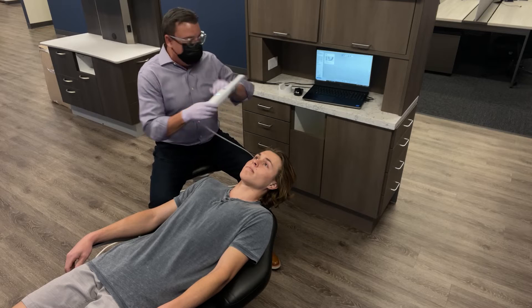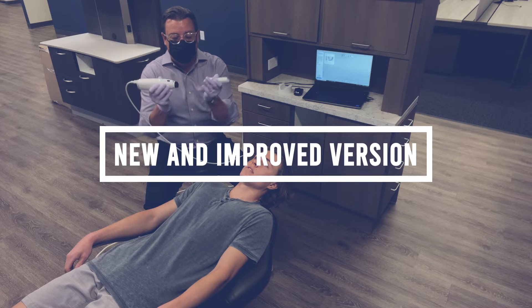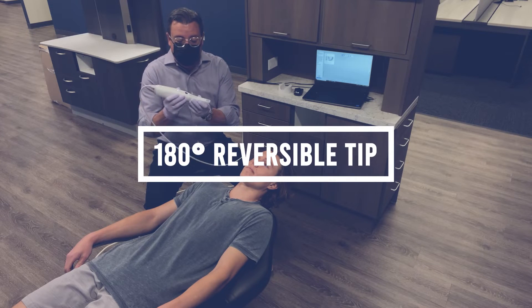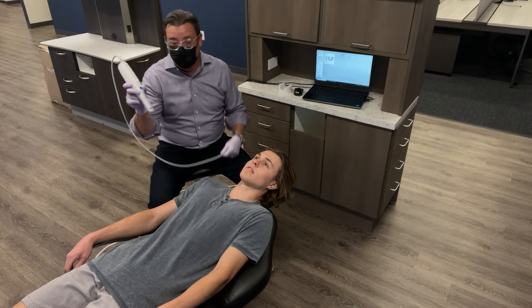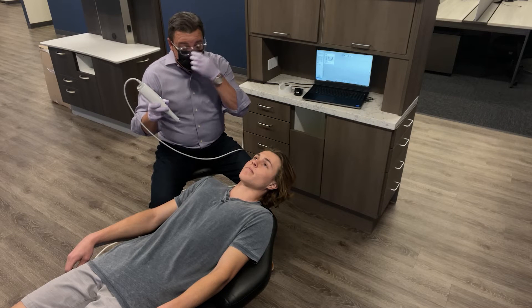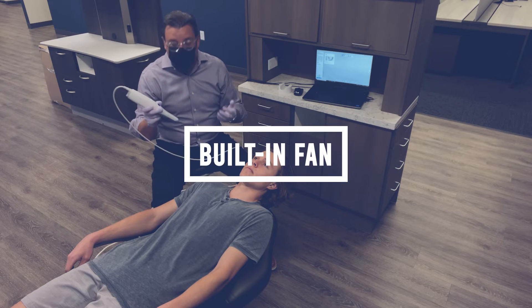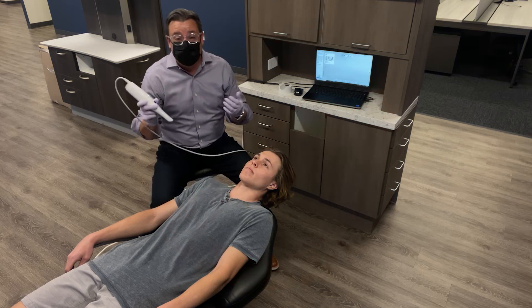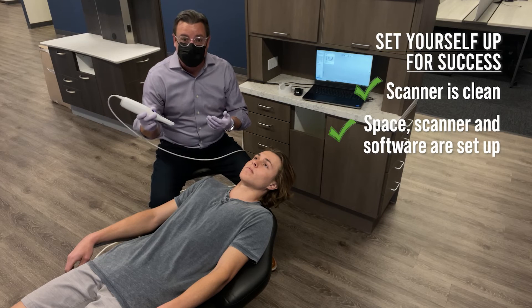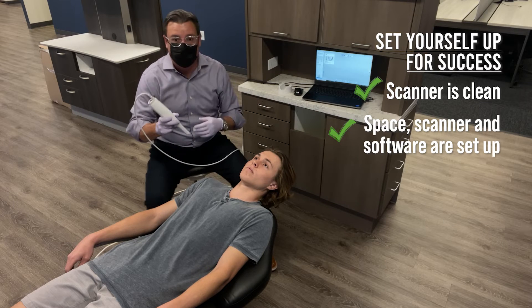A couple things about the Medit — this is the new version. A couple differences from the old one: I'm now able to take the scanning tip off and depending on which arch I'm going to be scanning, I can point it in that direction. What's nice is I now have my on-off button in the same place whether I'm scanning maxillary or mandibular. There's also a fan that prevents the scanning tip from fogging. With any scanner, you always want to make sure mirrors are clean and the camera lens is clean and you're ready to go before you start.